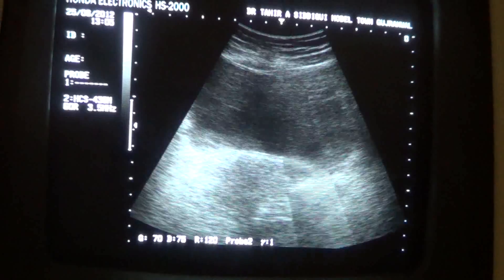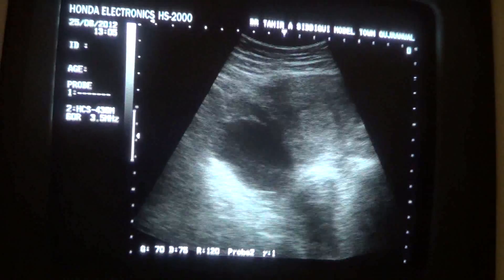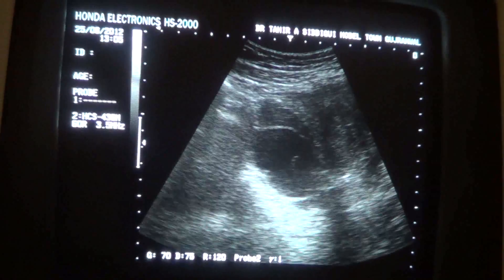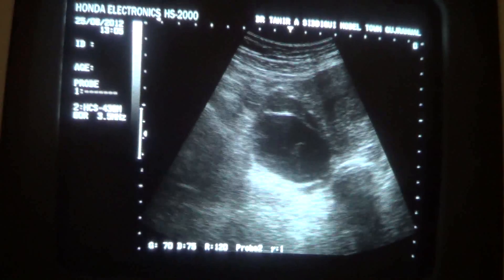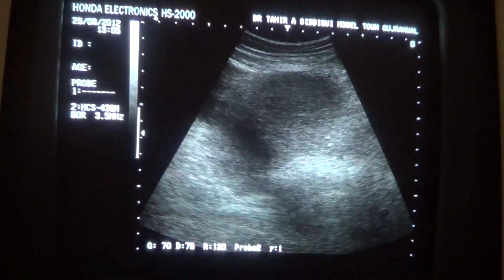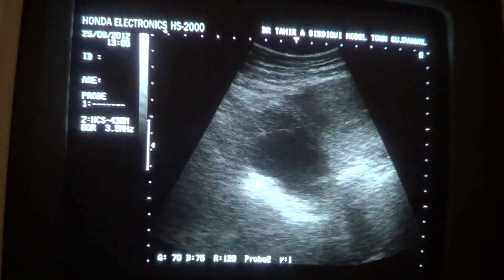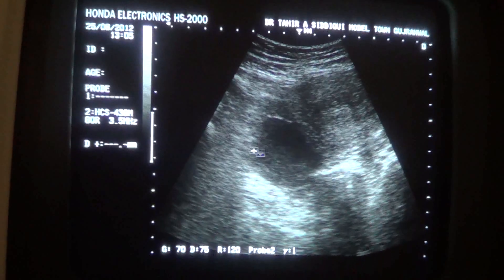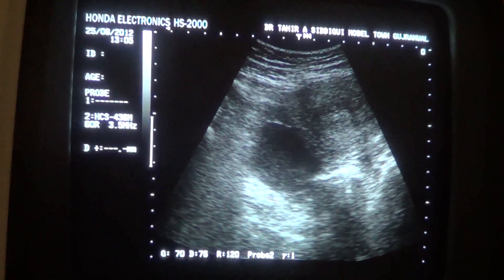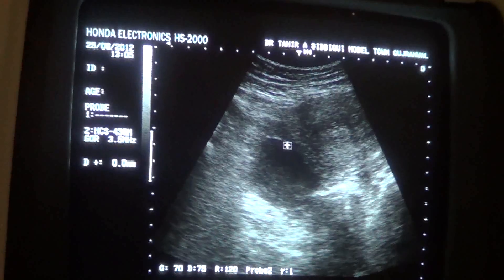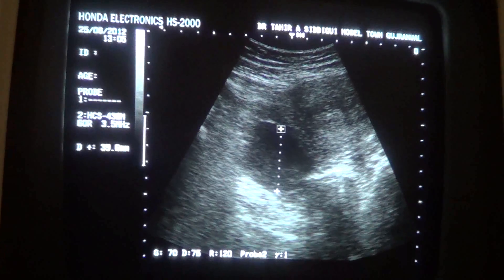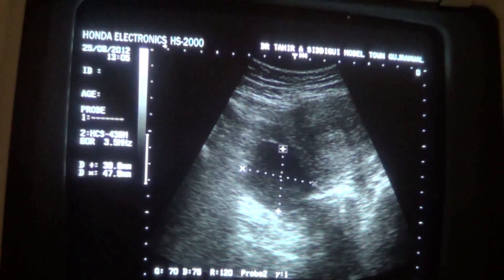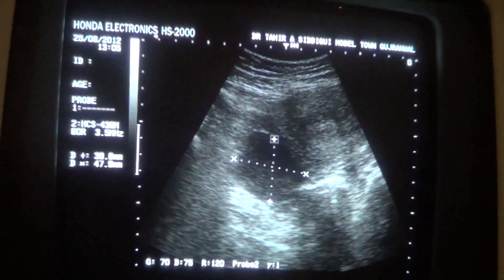Now, in the transverse section, we see a cystic area. This is the cystic area. This is the debris. This is the cyst, measuring approximately 3.9 to 4.7 cm.